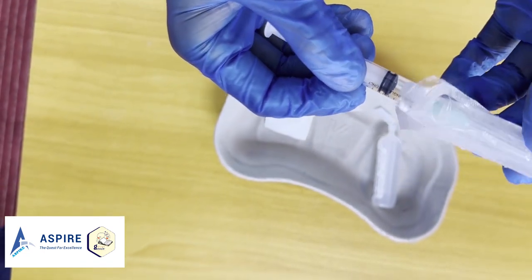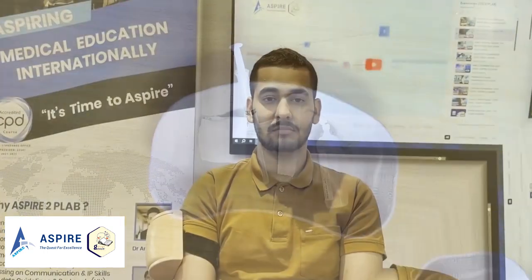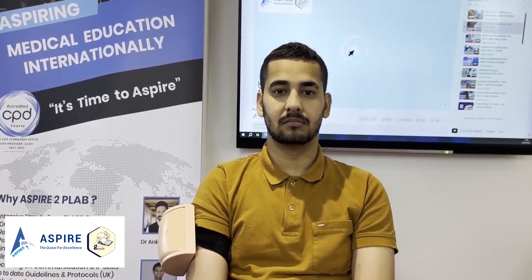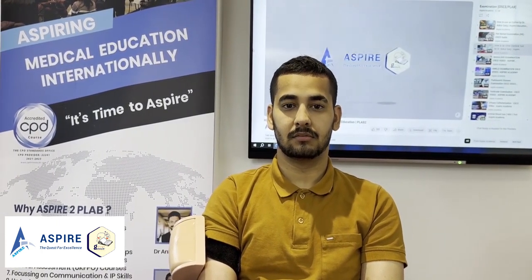Now let's go and prepare our patient. Before giving the injection, confirm the identity of the patient and ask about allergies. 'Are you Mr. John Smith?' 'Yes.' 'Could you please confirm your age?' '27.' 'Are you allergic to any medication?' 'No.'